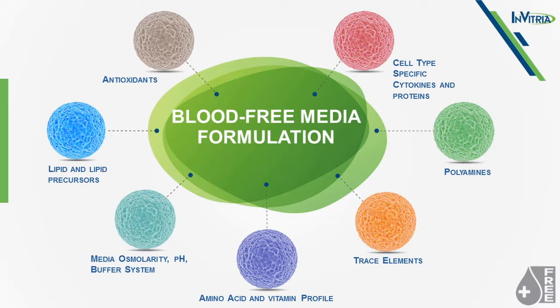Simply adding ITSE A into the base media that you currently supplement with serum just won't cut it. You'll have to consider several additional compartments within the media and optimize each of these, such as your antioxidant and polyamine trace element profile, your amino acid supplementation, and your water-soluble vitamin and lipid profiles.